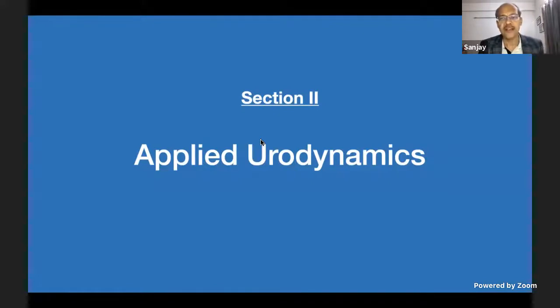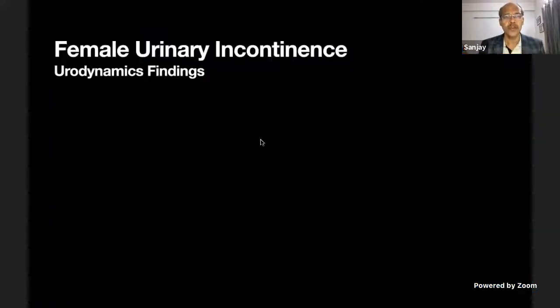And also let's try and answer the question relating to those 5 clinical conditions I told you about. So first, female urinary incontinence, and what are the possible urodynamic findings. I'm not going into the theory of when to do the urodynamics and so on. But typically you would plan to do an invasive urodynamics only at the point where you are looking at invasive therapies. That's what our guidelines, also the USI guidelines, state.